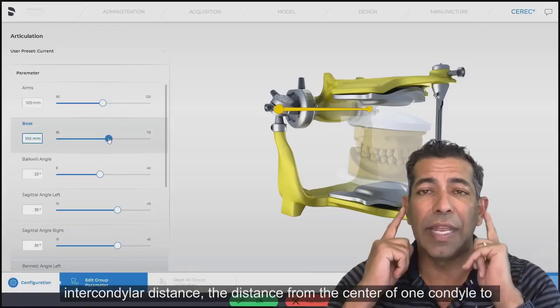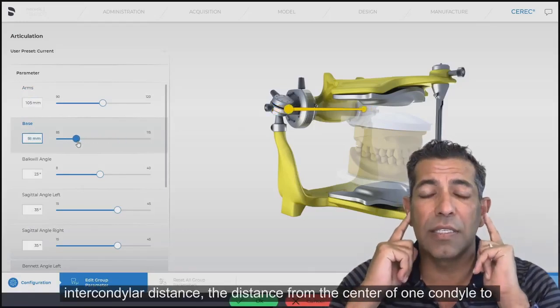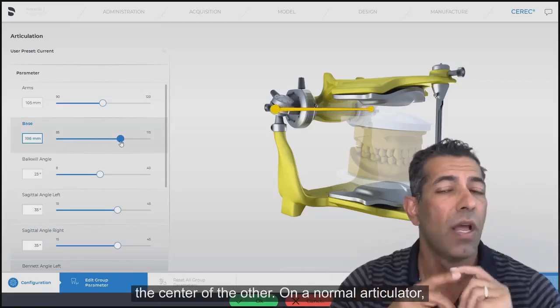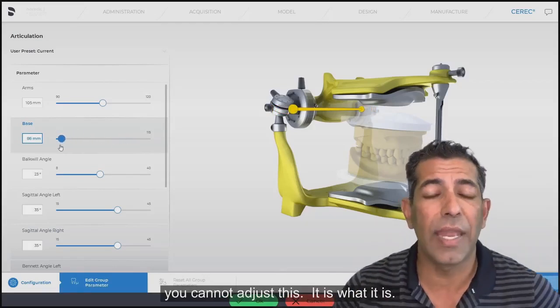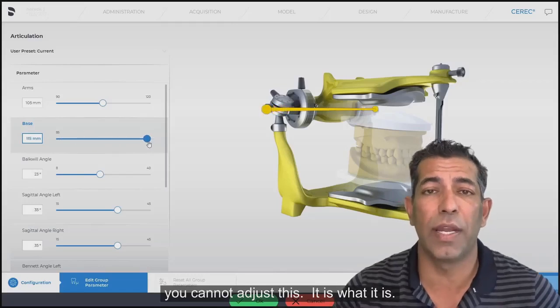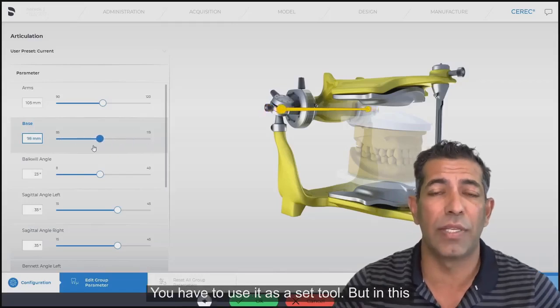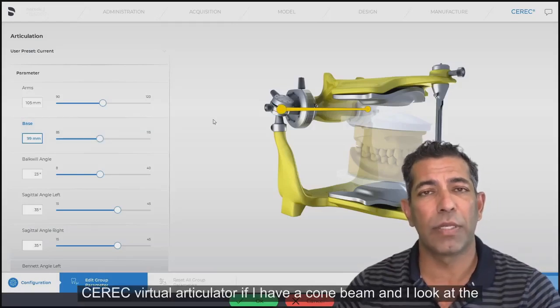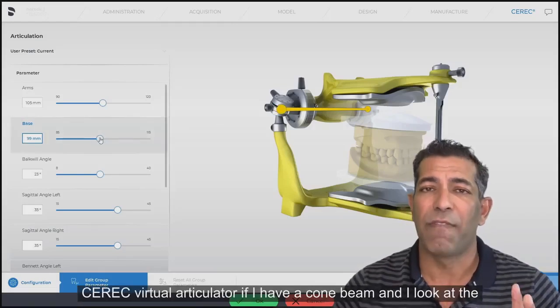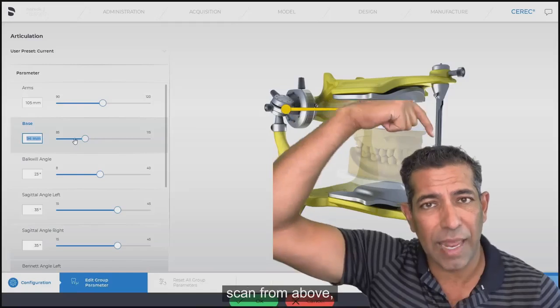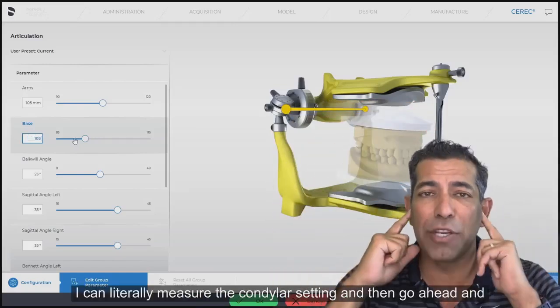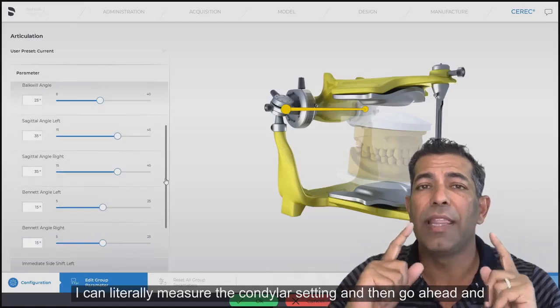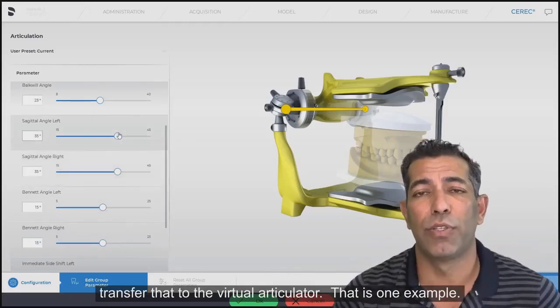The base is the intercondylar distance — the distance from the center of one condyle to the center of the other. On a normal articulator, you cannot adjust this; it is what it is. But in the CEREC virtual articulator, if I have a cone beam and I look at the scan from above, I can literally measure the condylar setting and transfer that to the virtual articulator.